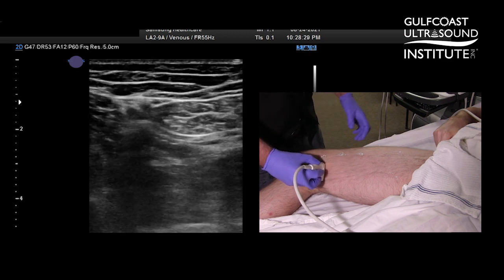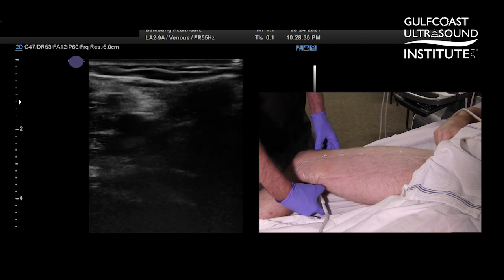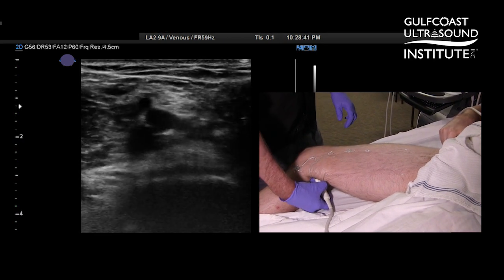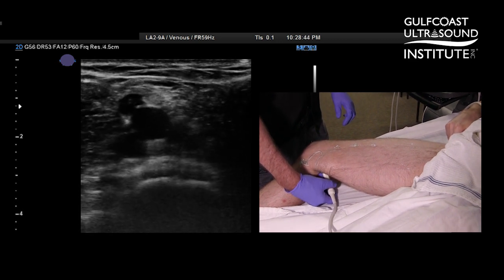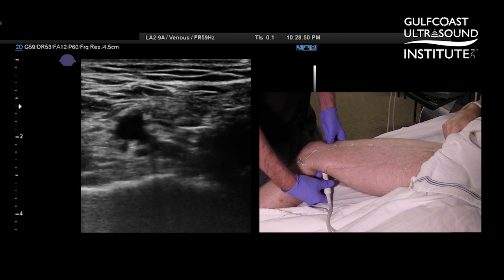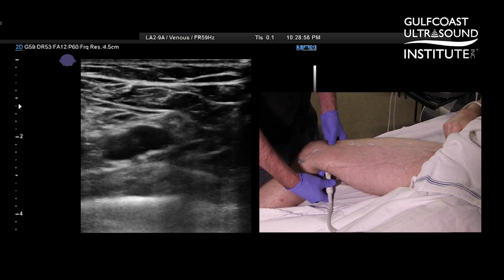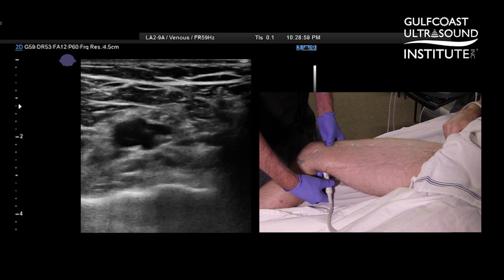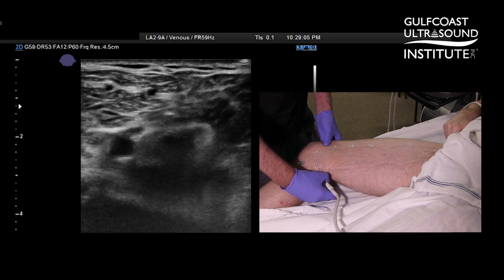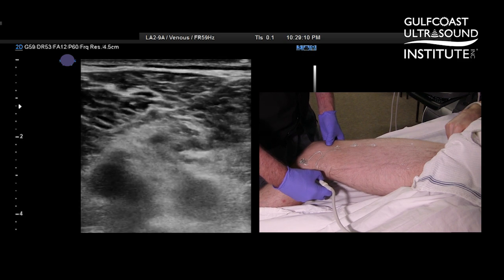It actually pushes that distal femoral vein at the adductor canal up closer to the transducer and makes it very easy to visualize as you go down toward the adductor canal area. At this point, with your indicator still pointing toward the patient's right, slide into the popliteal fossa and locate your popliteal vein. You can see it compresses fine right there. You can always slide back up the leg to backtrack and make sure you covered that adductor canal area sufficiently, because it is a common place for a clot to develop. Compress down through your popliteal fossa, distal popliteal fossa, toward the trifurcation area, and you're complete.